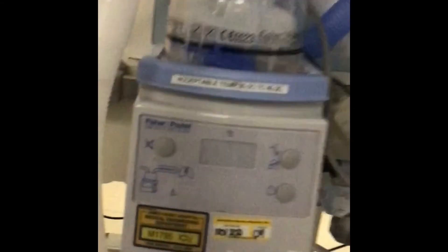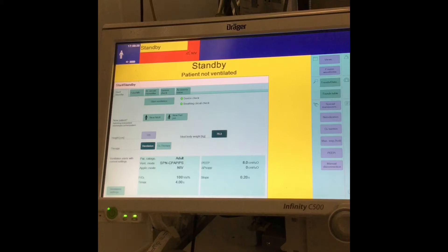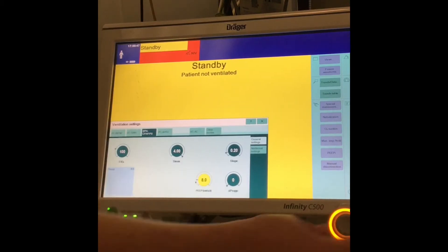The ventilator always needs to be on a warm humidified circuit and not a dry circuit. You'll then need to set your ventilator settings, which will obviously be dependent on what the doctor has prescribed for the patient. Hit ventilator settings and then adjust as you normally would.